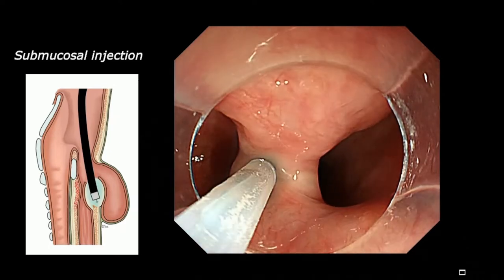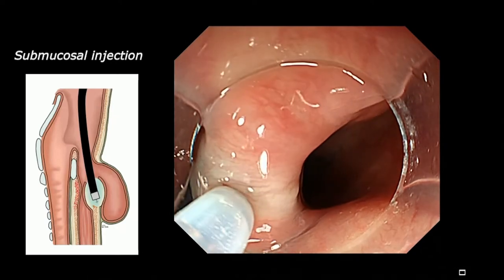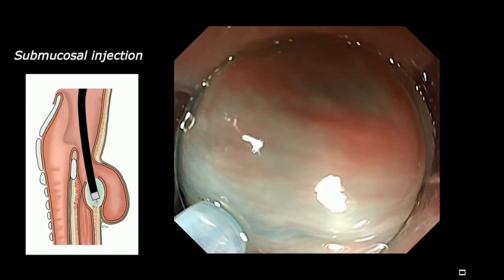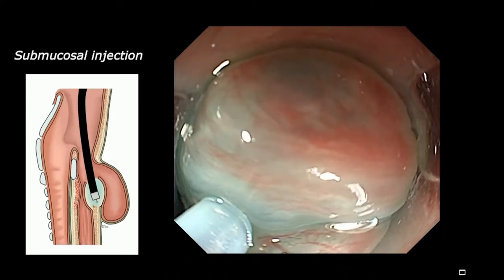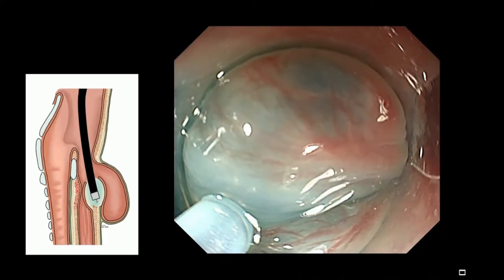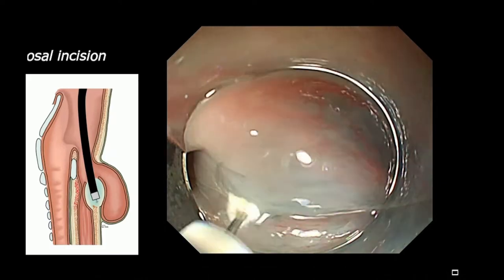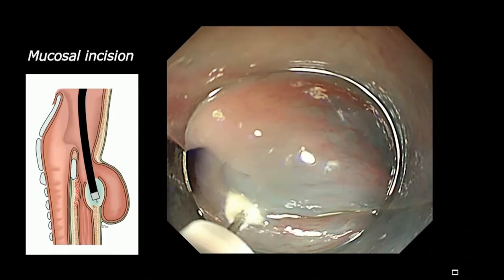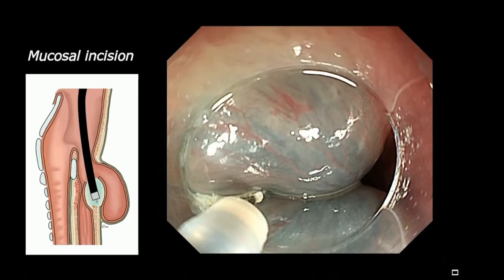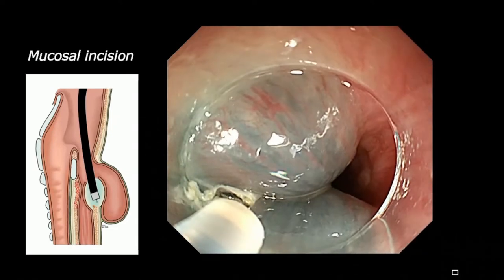So on the septum, now I inject — injecting — and you can see the mucosa is lifting. This is just saline without epinephrine. So now the mucosa is cut, same as Horst. We place almost a two centimeter mucosal incision.